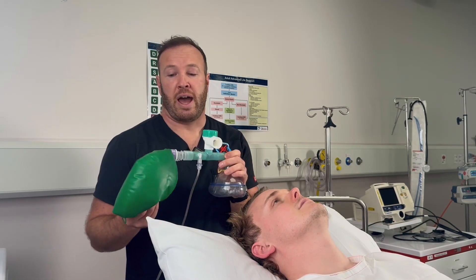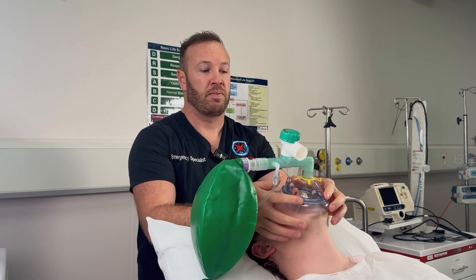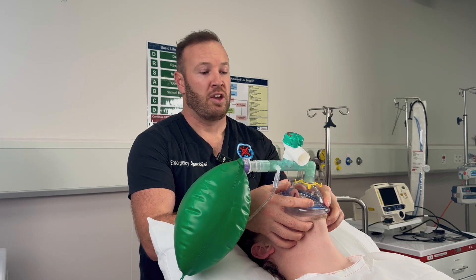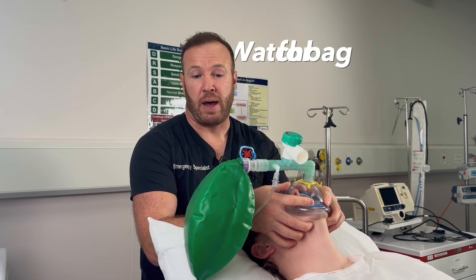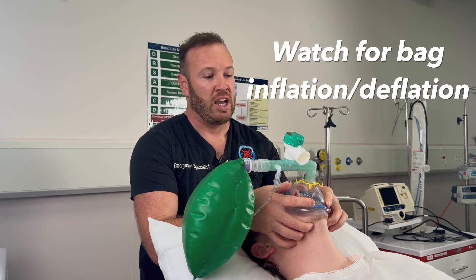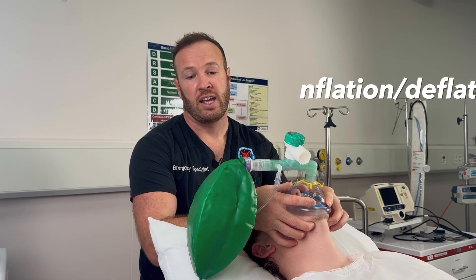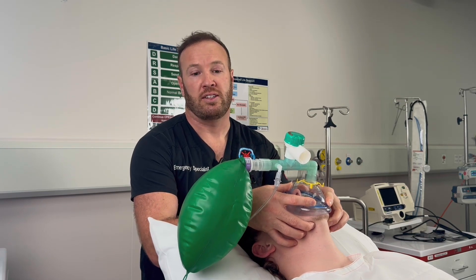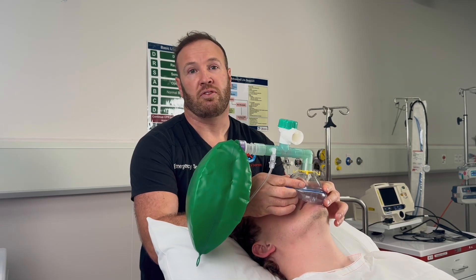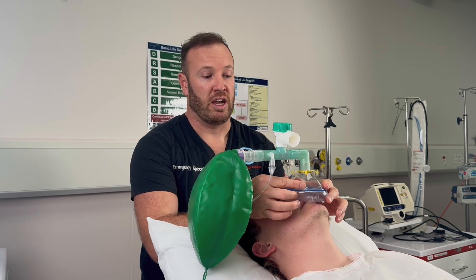Once the circuit is set up, place it onto the patient just as you would when ventilating them. I advocate using a two-handed technique because it's really important to get a good seal. Once you've got a good seal, you can see the bag inflating and deflating with each breath the patient takes — giving you a visual representation that the patient is moving enough air and an idea of their respiratory rate. The other advantage is that if you accidentally lose your seal, the bag is going to stop inflating, giving you immediate feedback that you need to adjust the mask and re-establish an appropriate seal.